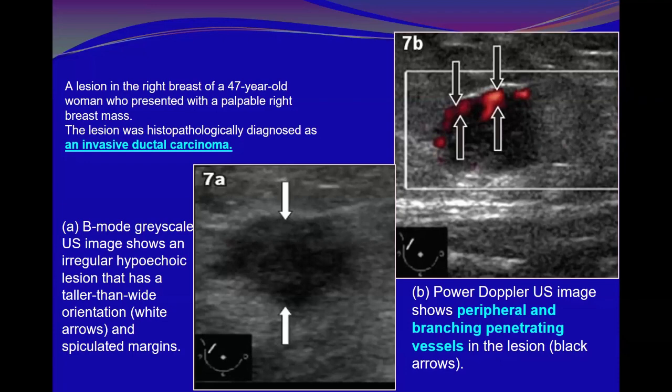In an abscess, I would see marginal vessels at the capsule and adjacent tissue, and completely devoid vascularity within the core. Here I have seen multiple peripheral feeding vessels with branching vessels penetrating into the mass. So from this vascular pattern, I will upgrade the lesion, and it was proven to be an invasive cancer.